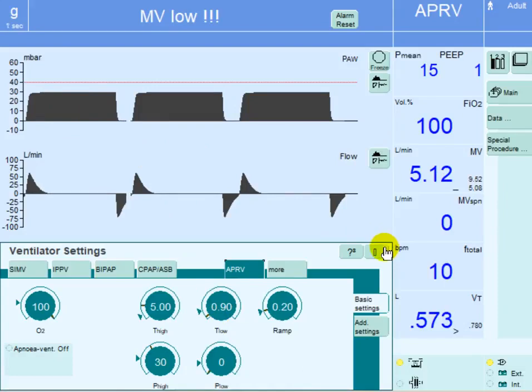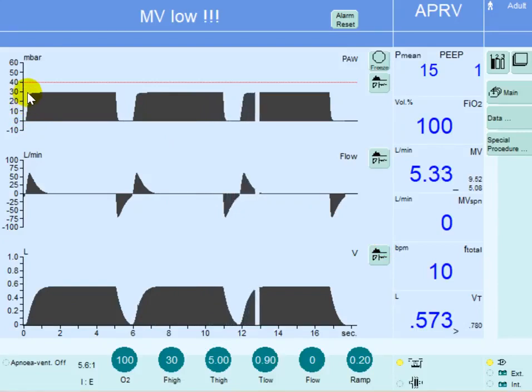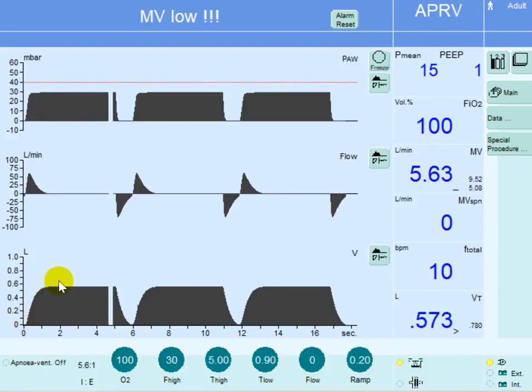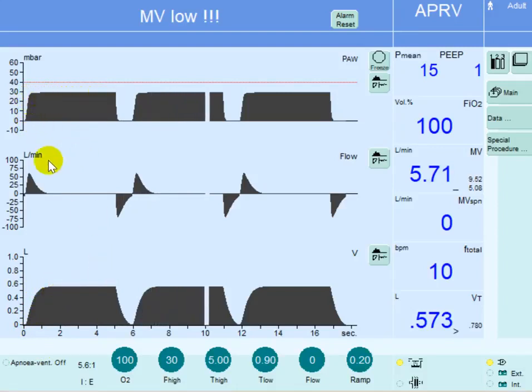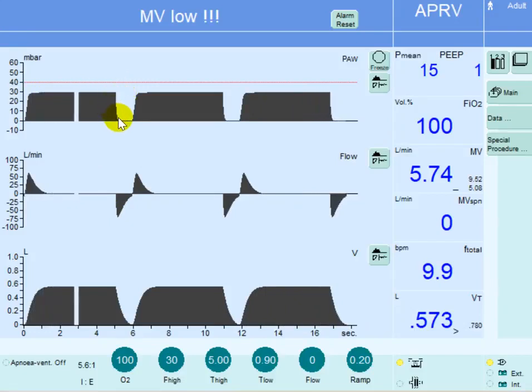You can see the pressure goes up to 30 centimeters of water in 0.2 seconds, which is the ramp. The inspiratory flow follows and volume goes into the lungs. This volume stays in the lung for the duration of inspiration and the flow reaches zero. The patient can breathe on top of this pressure, and then after five seconds the pressure is released all the way to zero and the patient exhales.